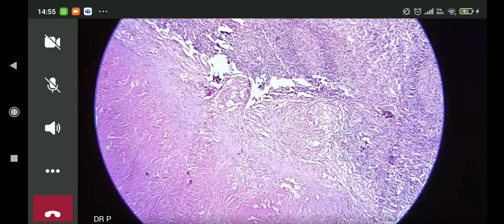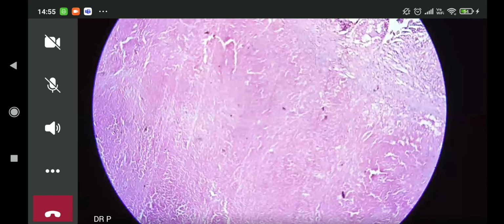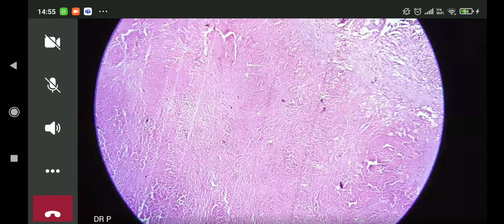And we do that by putting up the ZN stain, or the Ziehl-Neelsen stain. The Ziehl-Neelsen stain helps us to identify acid-fast mycobacteria, and they appear magenta colored. And that is how you pick up a definitive diagnosis of tubercular lymphadenitis. Otherwise, you just sign it out as granulomatous lymphadenitis. Once you put up an AFB stain and you see those magenta colored bacilli, then it becomes tubercular lymphadenitis. Definitive diagnostics: polymerase chain reaction. Okay, so there's PCR for TB.